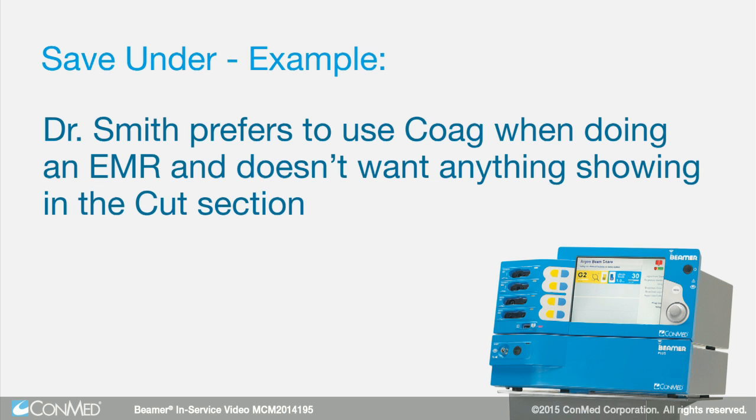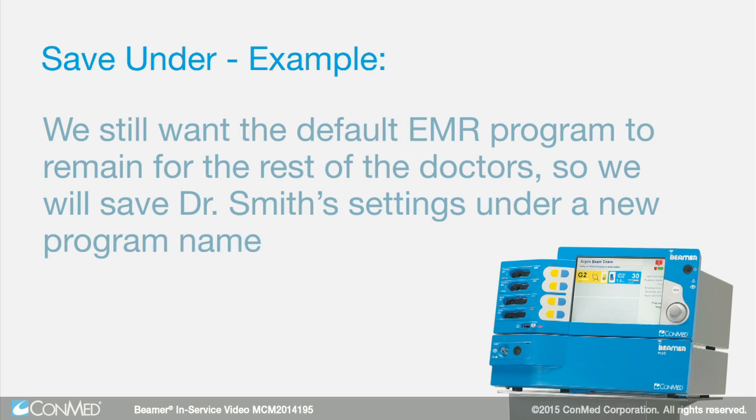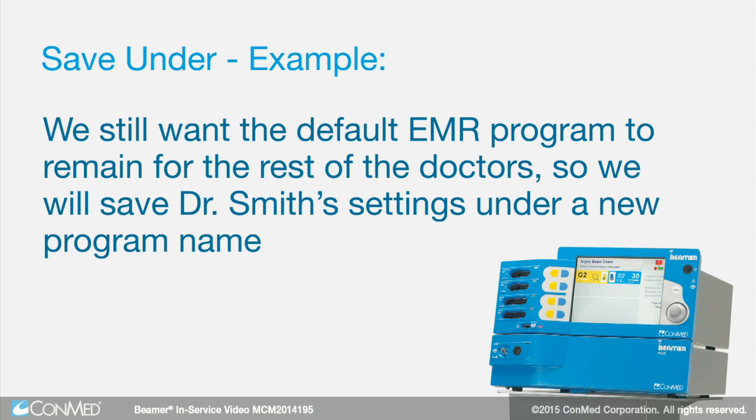As an example, we'll assume that Dr. Smith prefers to use Coag when doing an EMR and doesn't want anything showing in the Cut section. We still want the default EMR program to remain for the rest of the doctors, so we will save Dr. Smith's settings under a new program name.